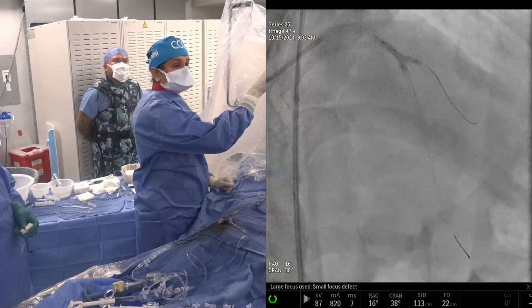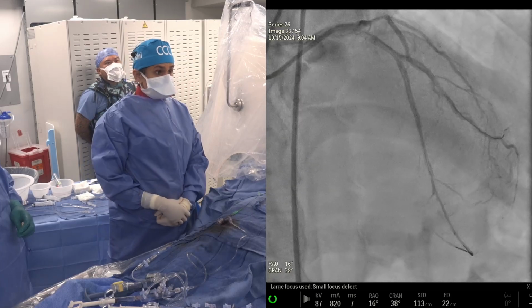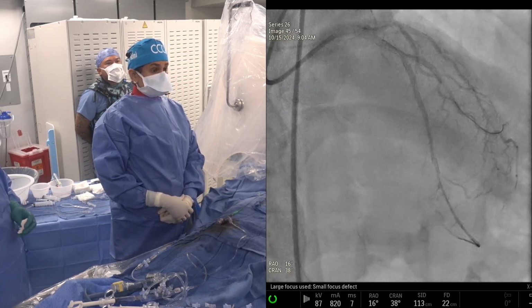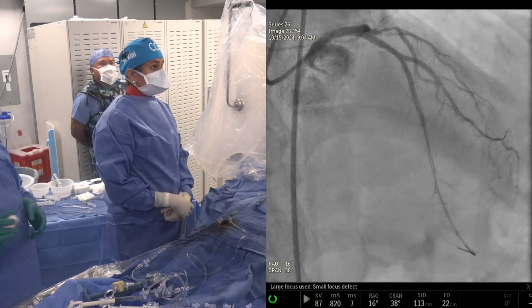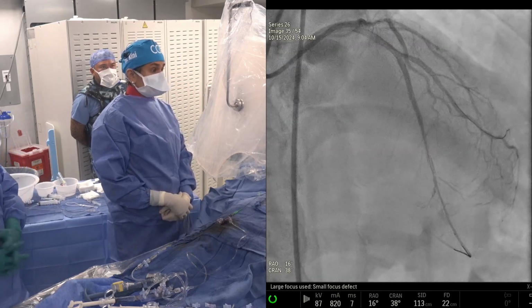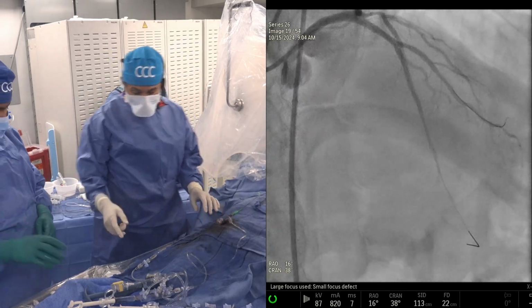Then we did the kiss, and this is where we are. Look, so much background work went into creating this outstanding result. Each step addressed the diagonal, getting back the balloon for the final kiss, the part for the lesion, just all excellent learning steps. And there's a little dissection. We're doing a prolonged balloon inflation.